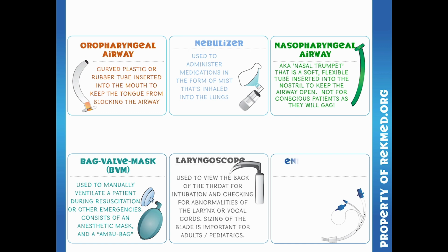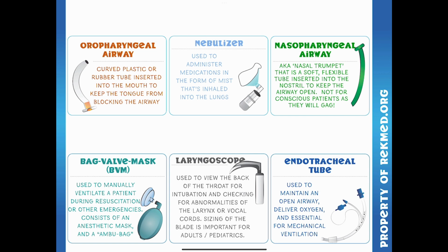And lastly, we have this endotracheal tube, which we're going to get into so much more in another lesson. And this is used to maintain an open airway, deliver oxygen, and is essential for our mechanical ventilation.